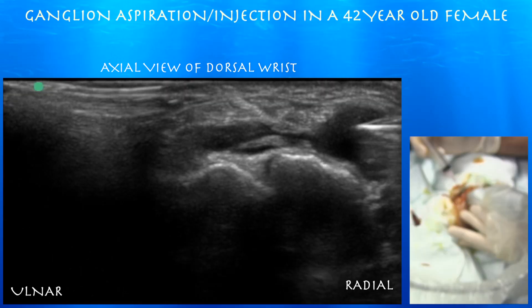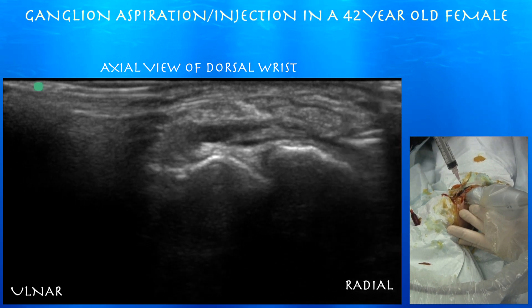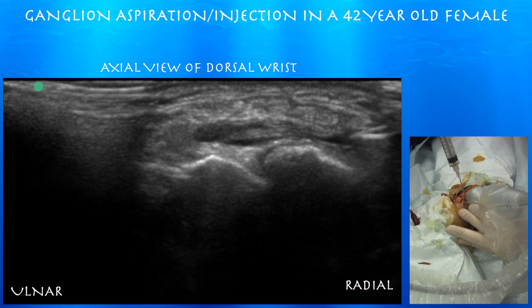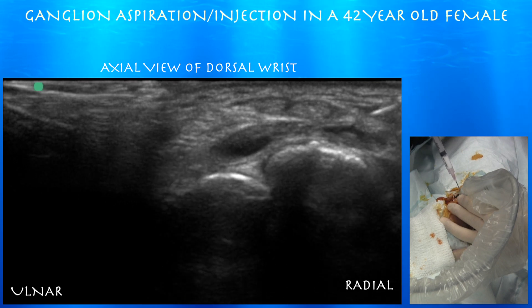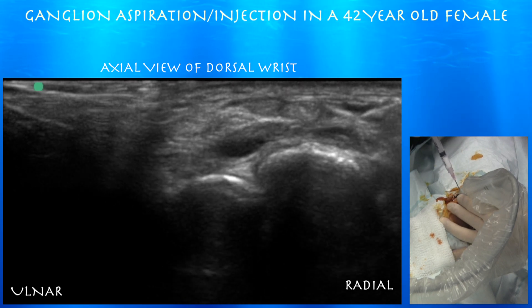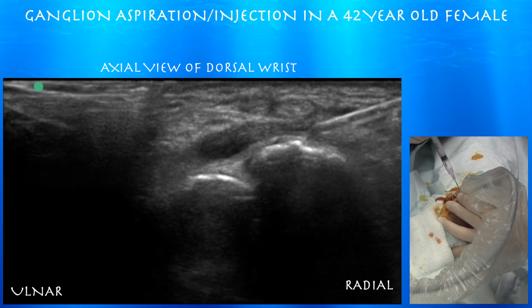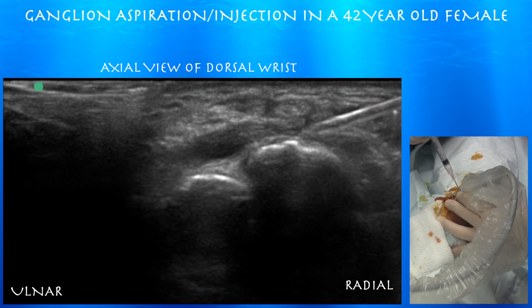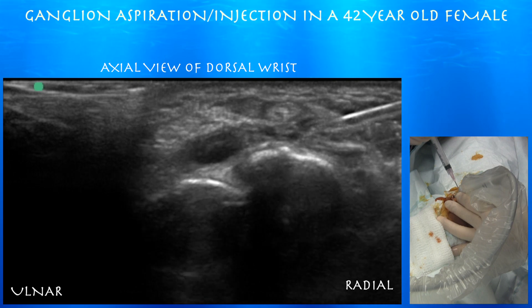Here we are starting the procedure, going from the very lateral or radial aspect of this cyst, which is pretty easy to access. We got most of that cyst, though some may remain in the medial part. Here we're trying to inject some cortisone — it looks initially a little bit superficial, so we advanced the needle a little bit deeper to where it was when we drained the cyst, and then injected the rest of the cortisone. Here you can see some of the residual ganglion we were unable to aspirate during the procedure.